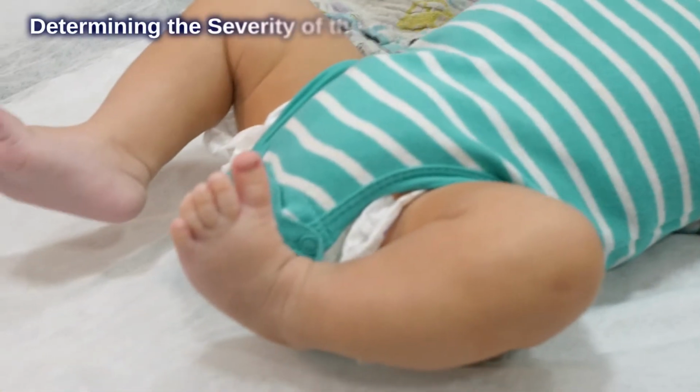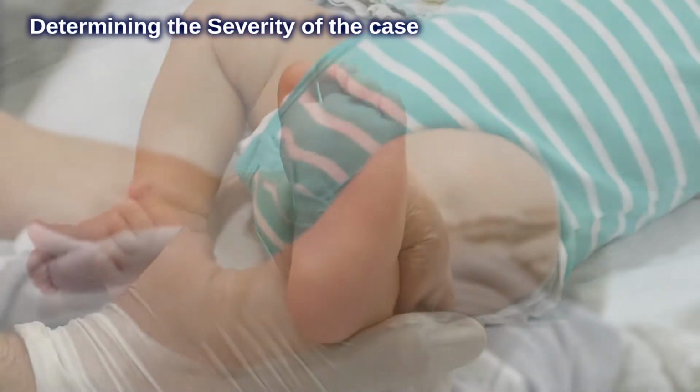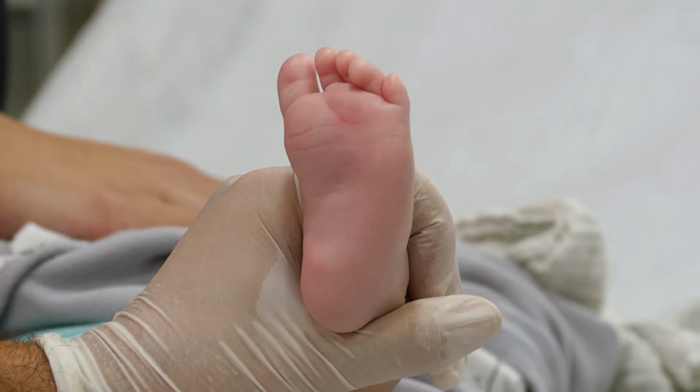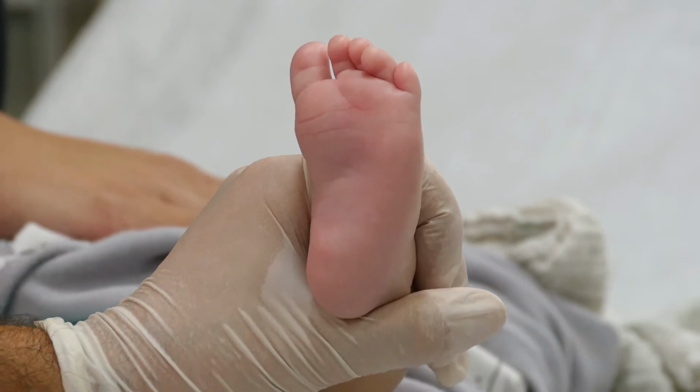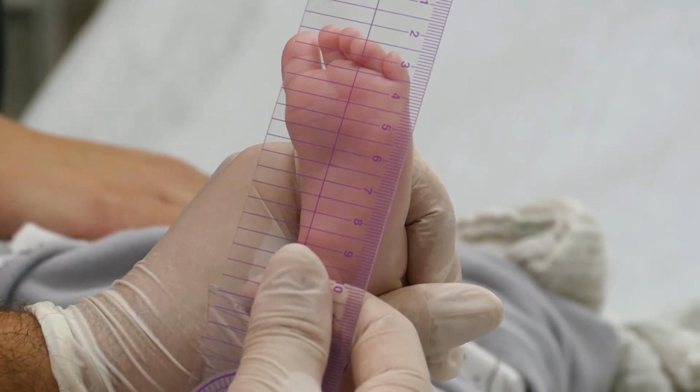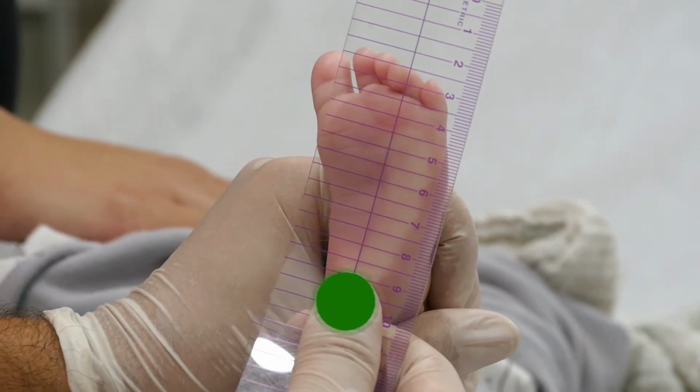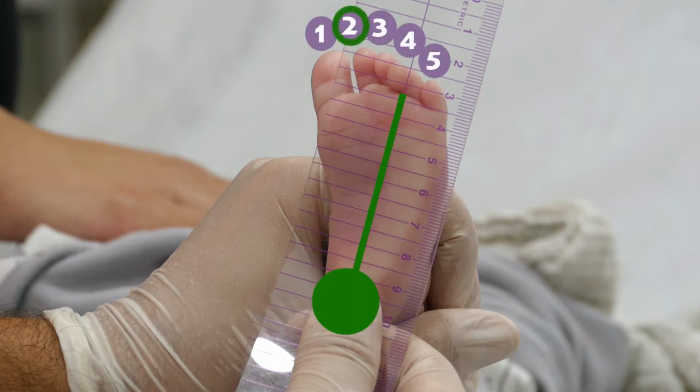The 3 types of parameters are considered to determine the severity of the case. The first one is the heels bisector classification, which is performed using a ruler according to Bleck's method. Put the ruler in the middle of the heel and check the heel bisector line. The ruler should properly point towards the second toe.